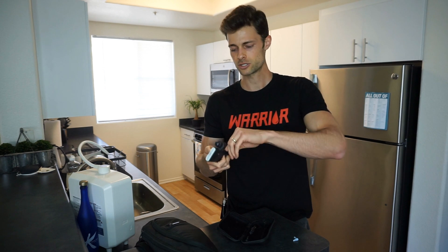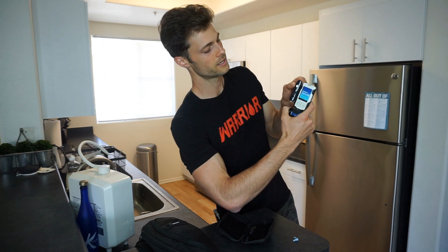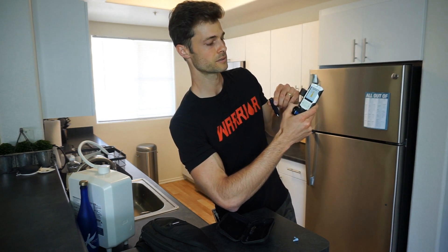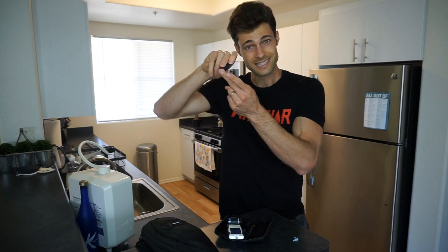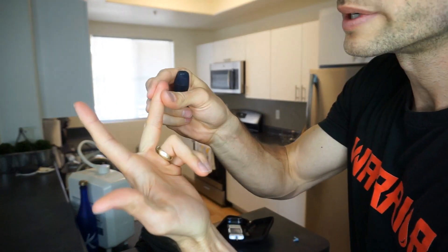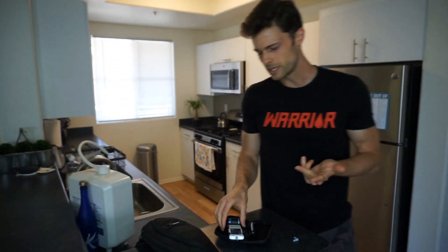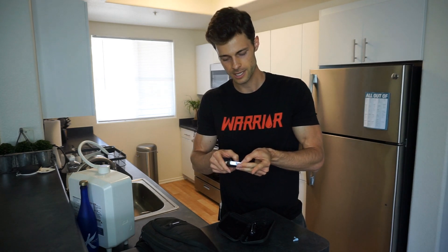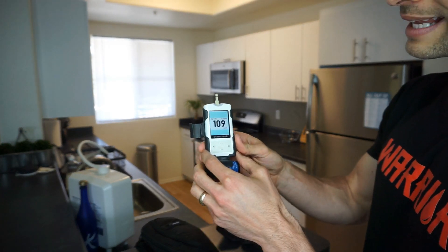I'm going to take a test strip out and put it in the meter. When I do, it's going to turn itself on. Now it's going to say 'apply blood' — as you can see right there. I'm going to go ahead and gear that up, go for the side of my finger. I'm going to squeeze some blood out — there it is. That looks like it's enough. Quick note: if you have to squeeze very hard to get the blood out, I wouldn't use that. I would retest and get new blood, because the more pressure you apply, the less likely it will be accurate.